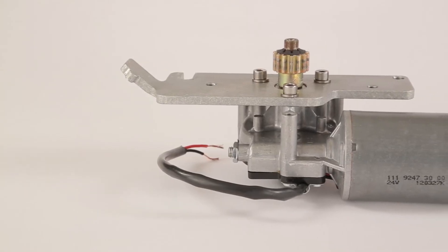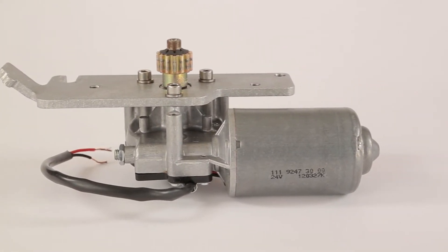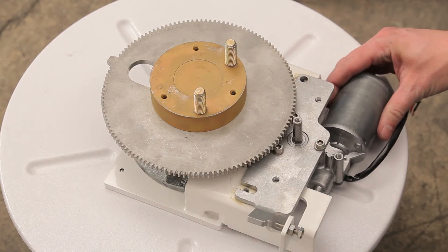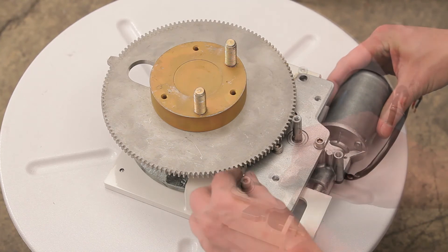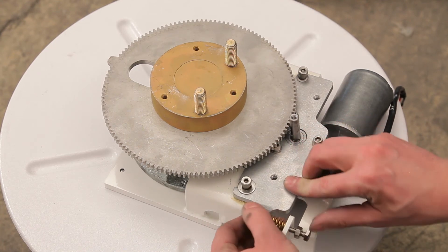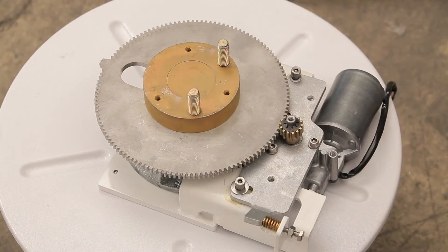When removing the motor assembly, make sure to retain the tension spring that fits between the motor assembly plate and the base frame — this spring will need to be reinstalled with the new motor assembly. When replacing the assembly, align the holes in the motor assembly mounting plate with the holes in the base, insert the screws and tighten. Next, insert the tension spring onto the tab in the mounting plate and slide the spring over the tension adjustment bolt installed in the base frame.